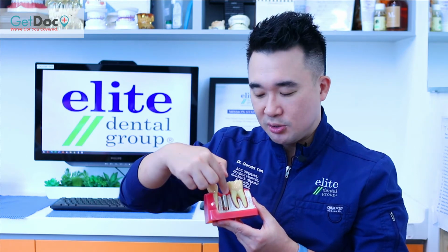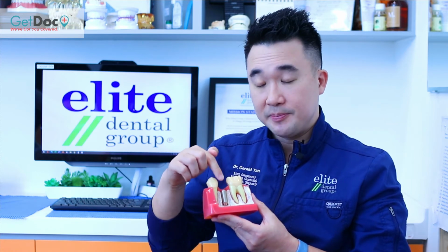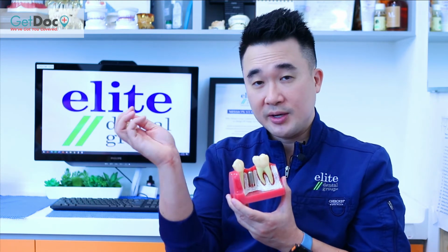However, if the implant fails, if the implant does not integrate well with the bone, if there is a massive gum infection around the implant, or if the implant somehow destabilizes, or if the implant is broken under heavy load, then it's more of a hassle. Usually there's a surgical procedure to remove the broken and failed implant, and a bone graft is placed, and a healing period needs to go by before a new implant is attempted. So the failure can occur at the abutment or the crown level, or at the implant level. Crown and abutment level failure is much easier to manage, but failure at the implant level is a headache, and that usually involves some kind of surgical procedure.